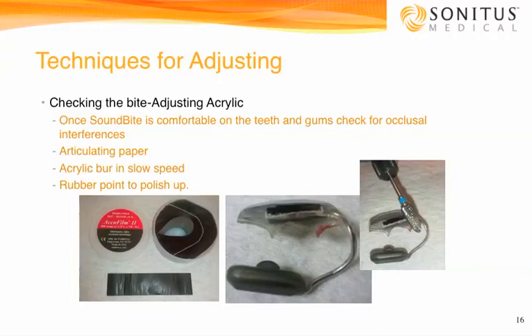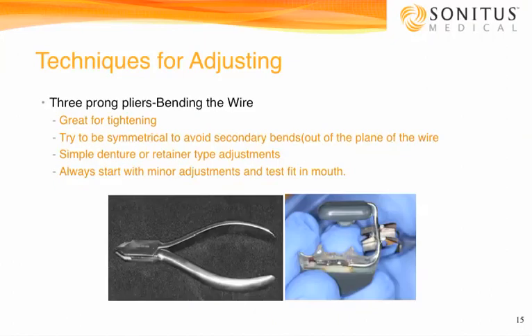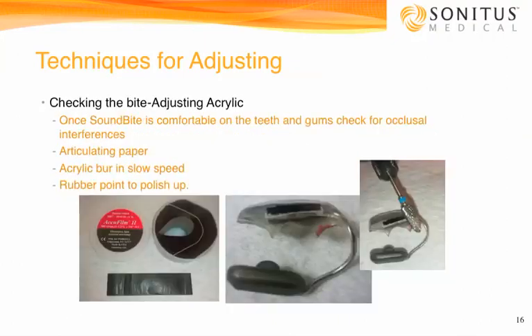These things are very simple things to do, and these are probably the 2 most common adjustments you'd have to do: the bending of the wire to tighten it up, and then potentially a little bit of acrylic removal if a patient's biting on it. And these are extremely simple things to do in the office. Any questions, talk to your partner dentist or call us here at Sonitus or send us email or what have you. But these are some things that you're going to see your patients needing.